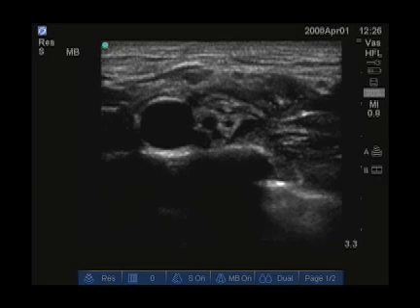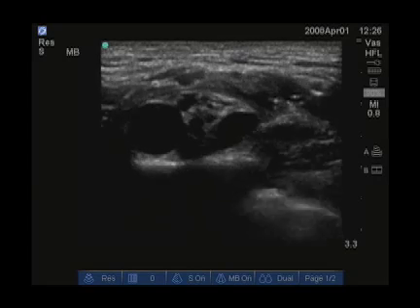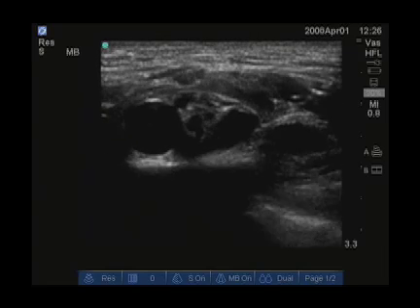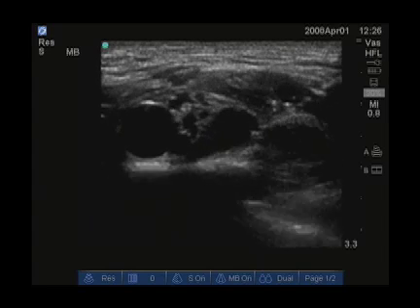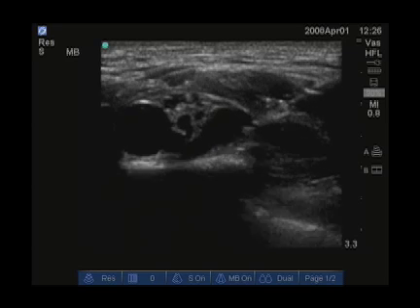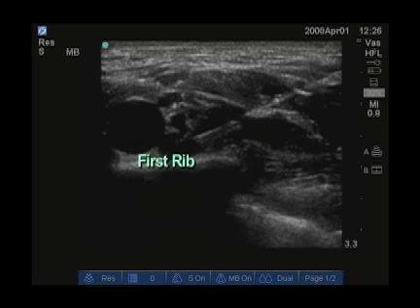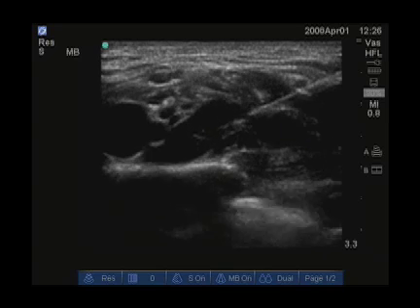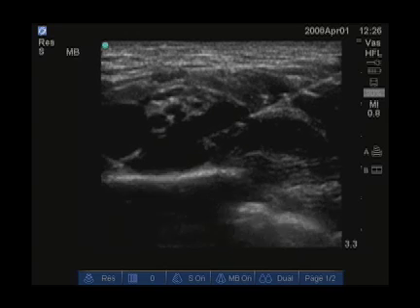This is an example of a supraclavicular injection. The first injection is lateral to the nerves. Our needle is barely visible because it is at a steep angle, but as the needle is flattened out we will see it better. You can see the pulsating subclavian artery sitting on the first rib, and you can even see pleura out more laterally.